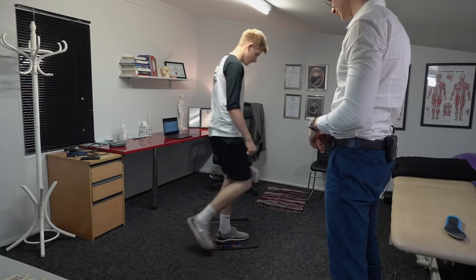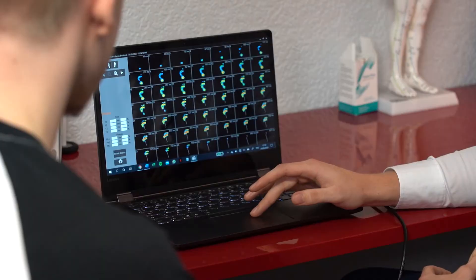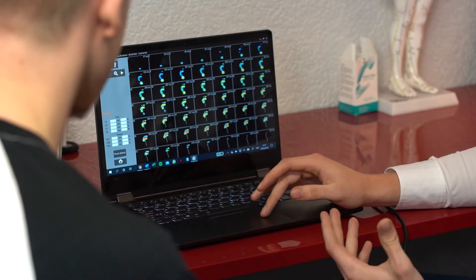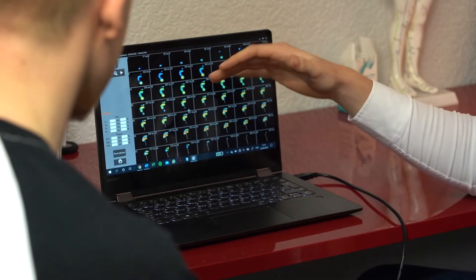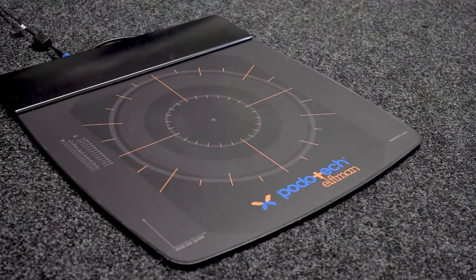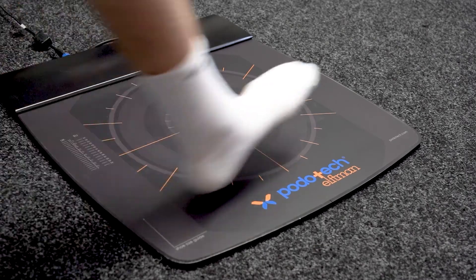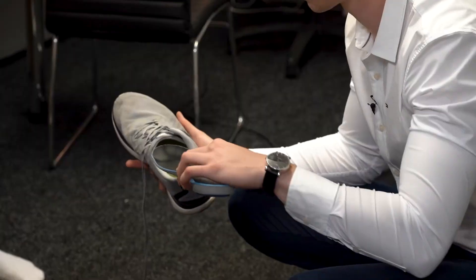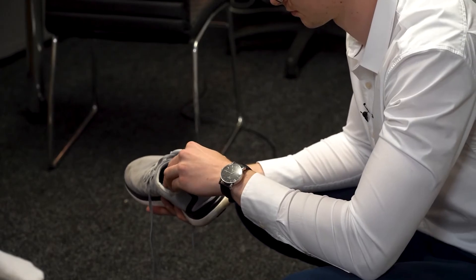The postural section. Here we measure postural sway, which is particularly important in the athletic population where balance is paramount. The plate can be walked over in shoes and barefoot. This is key in enabling me to monitor the effect of any insoles that may be prescribed to you as part of your treatment plan.